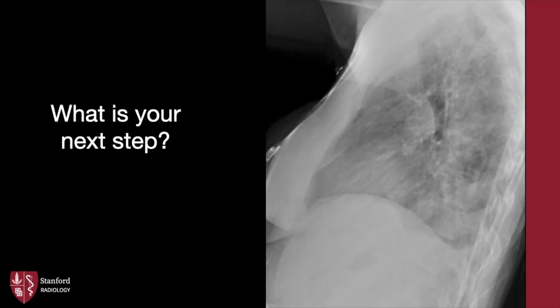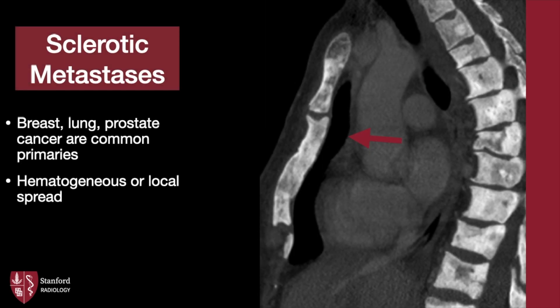What is your next step in this patient? The sternum is difficult to see from overlying artifact, but note all the bones demonstrate increased density. Our next step is to get a CT. Here, there are diffuse sclerotic metastases. Breasts, lung, and prostate cancer are common primaries. Always keep a high index of suspicion for malignancy whenever you detect a sternal lesion.